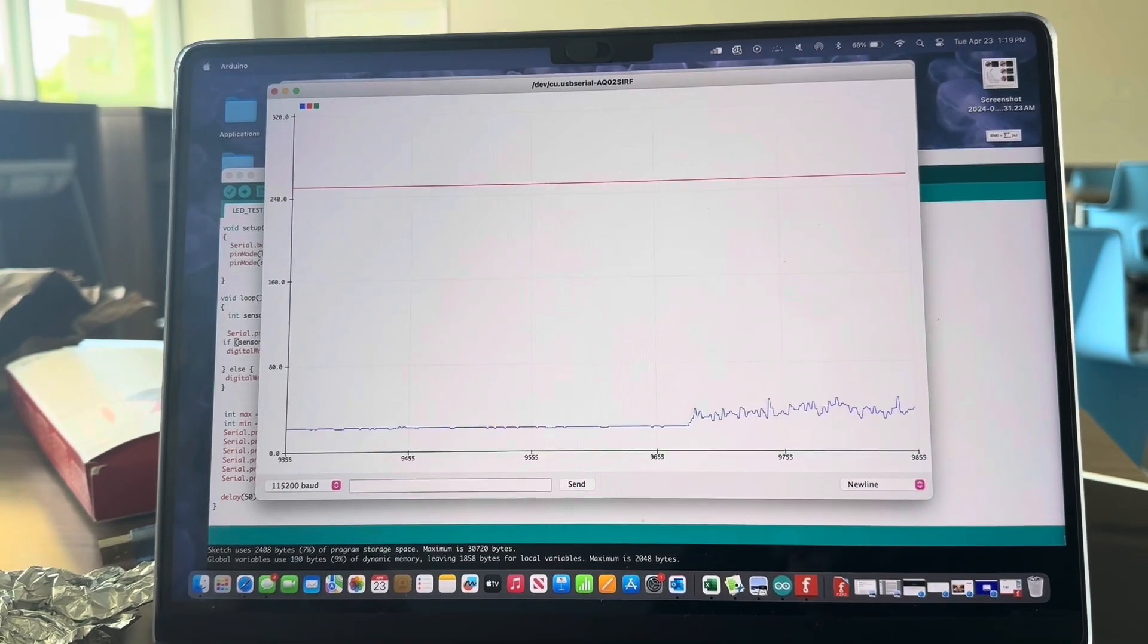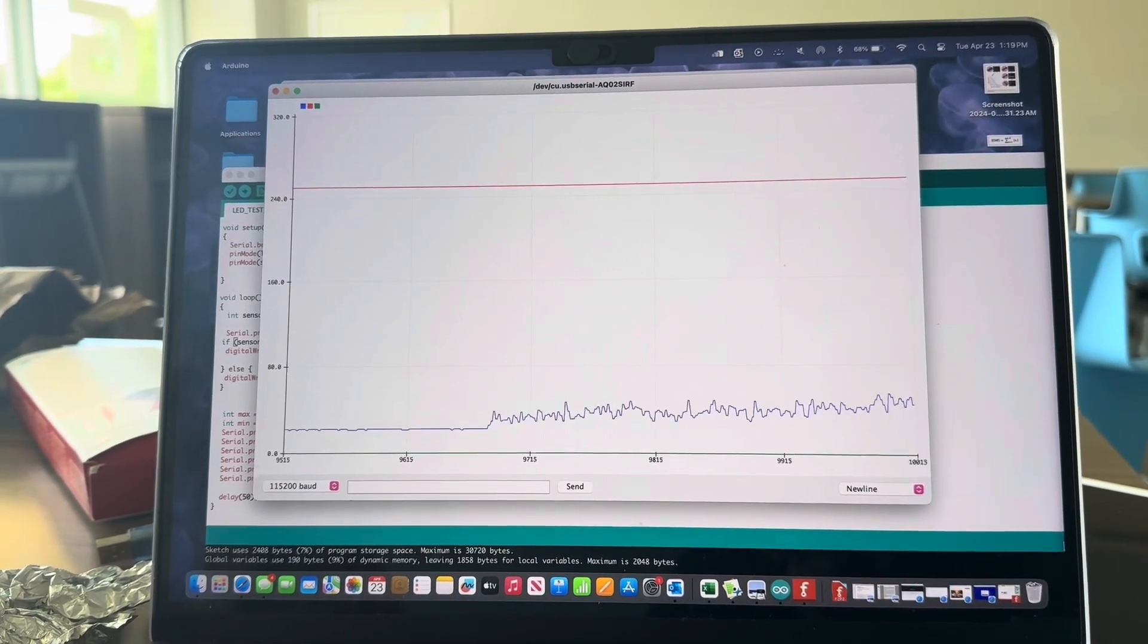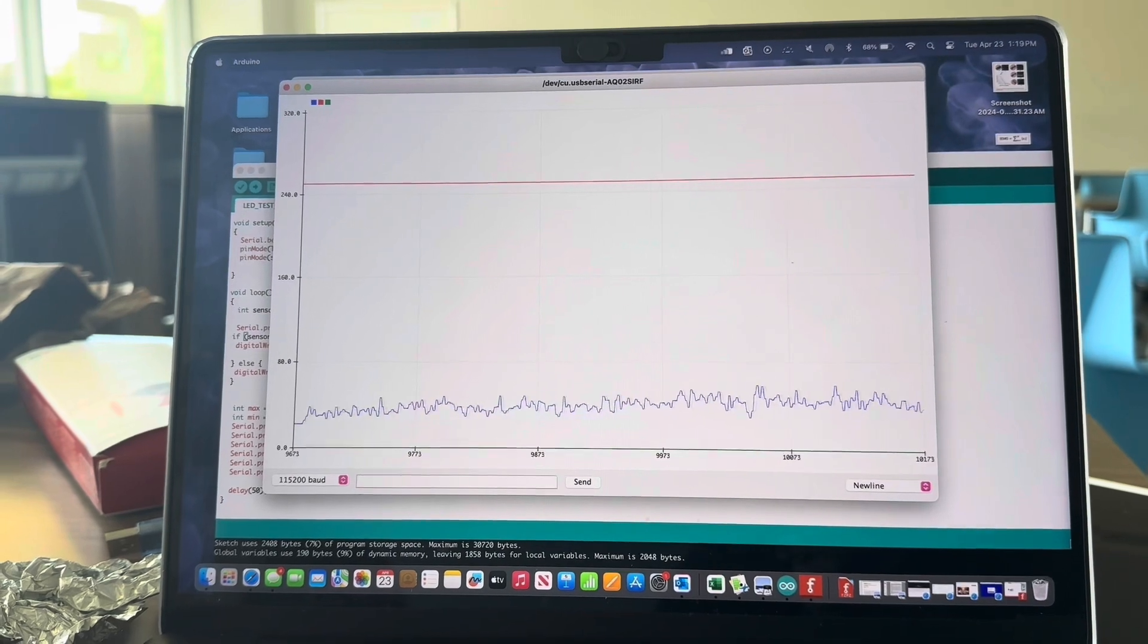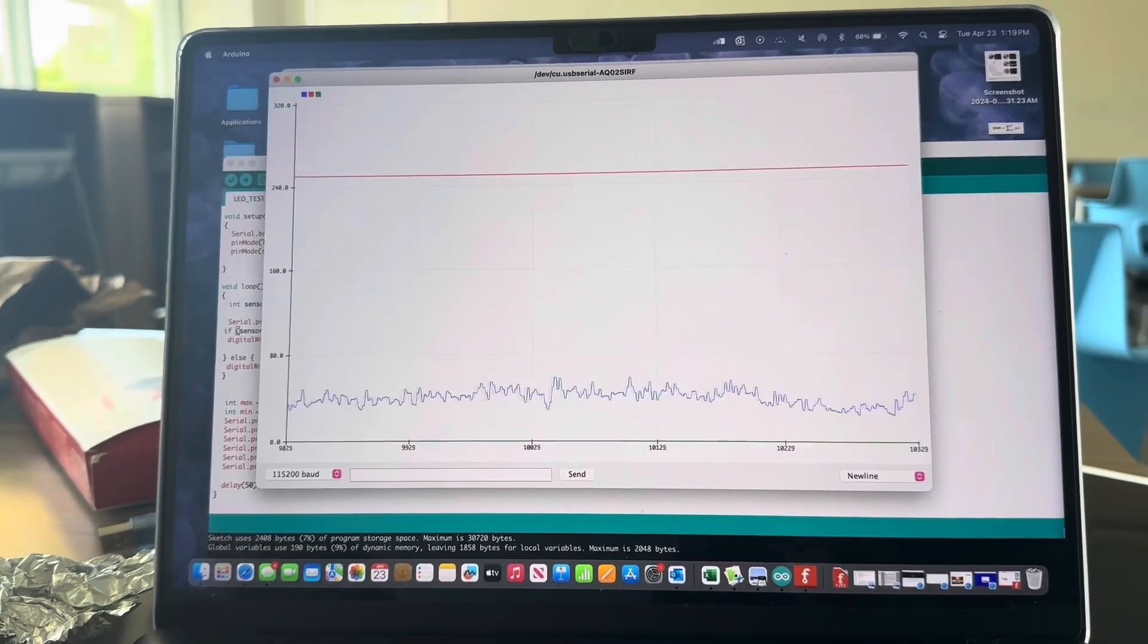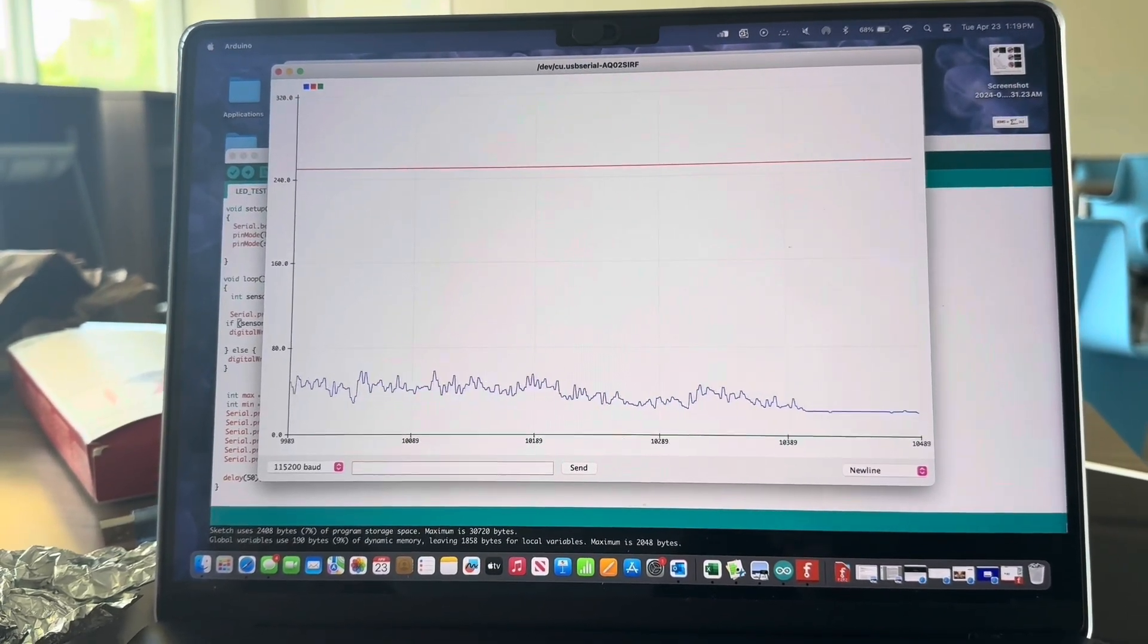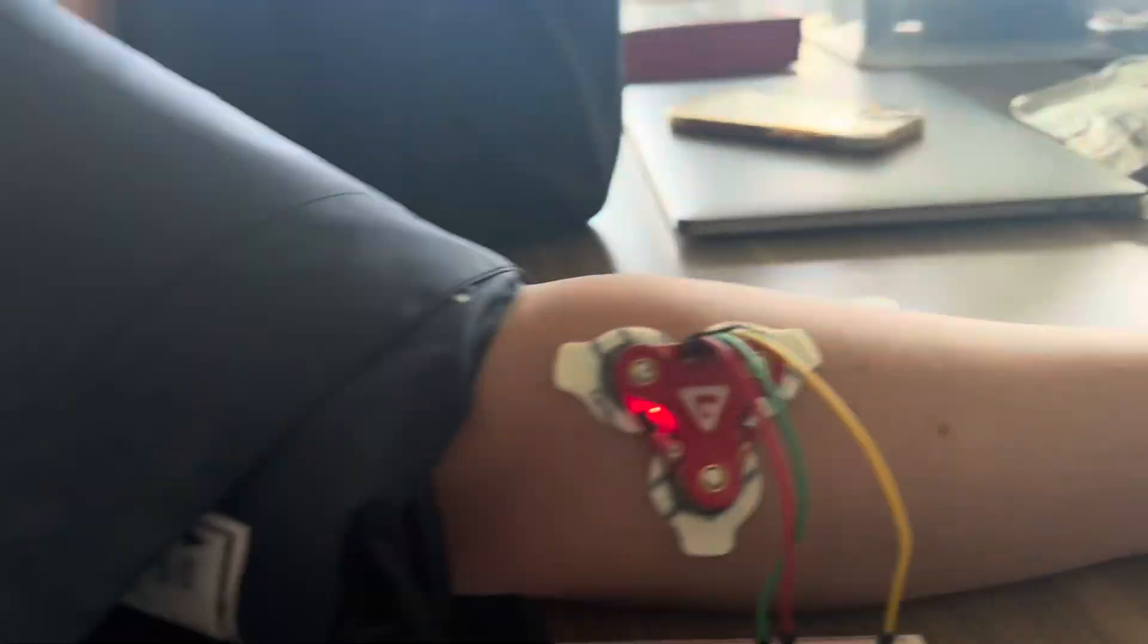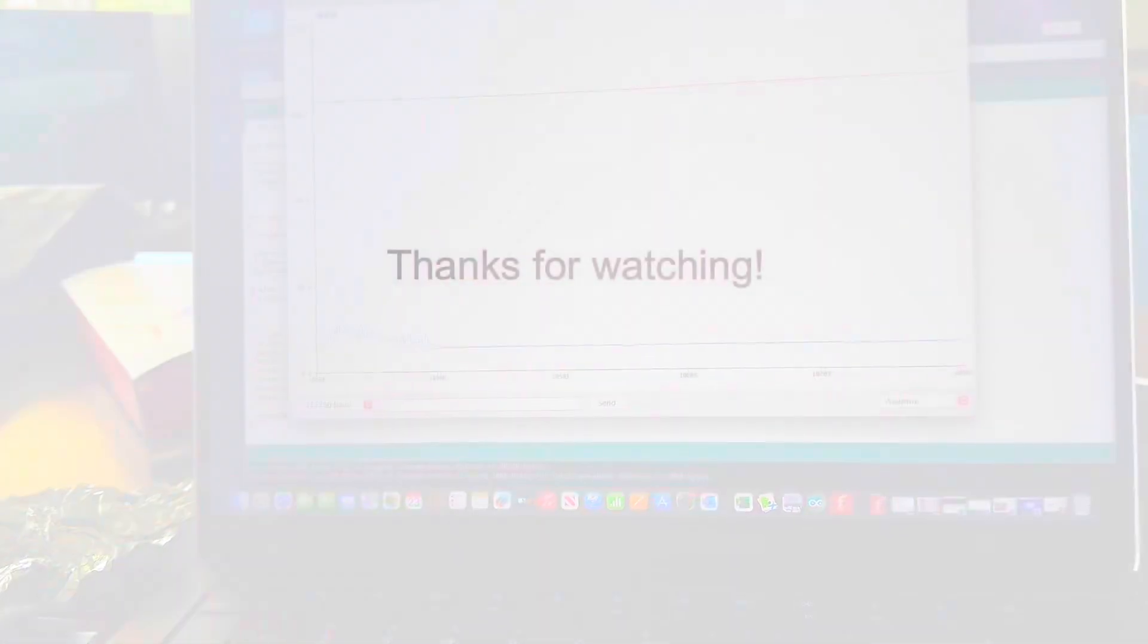Now as you can see, the EMG activity has drastically increased with the increase in blood pressure. And then when we release the pressure from the blood pressure cuff, the baseline values return to normal. Thank you everyone for watching.